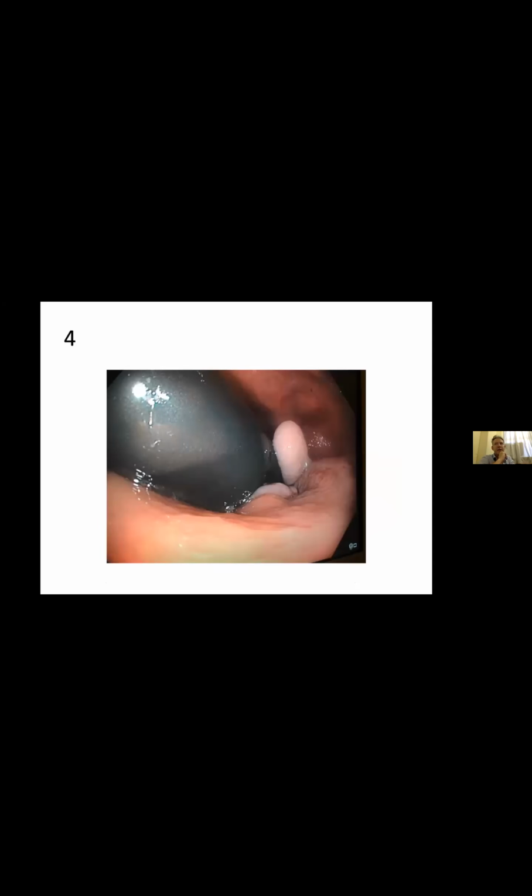If you retroflex like you should do at every colonoscopy, and you see a polyp like this, it's a fibroepithelial polyp arising from the dentate line. It's usually in someone who's got hemorrhoids and there's prolapse of hemorrhoids in and out, and they develop this sort of irritative polyp. Unless it's causing the patient symptoms, you can completely ignore it.